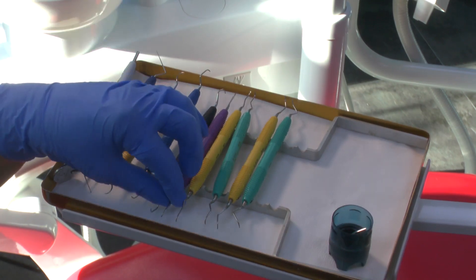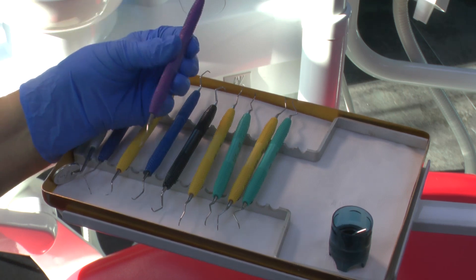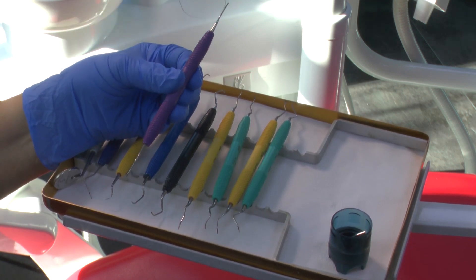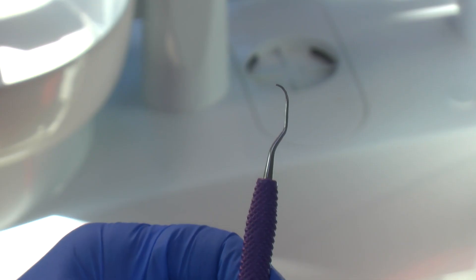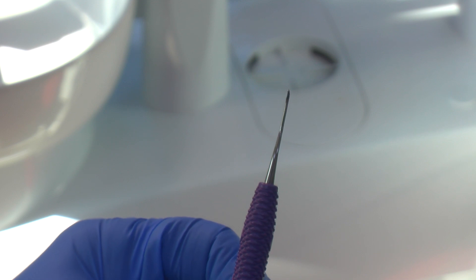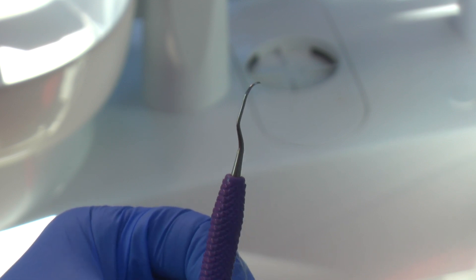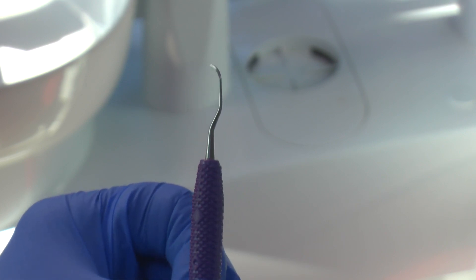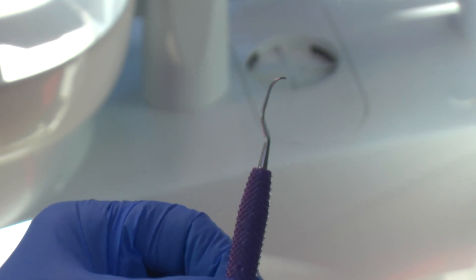The next instrument is a Gracey. This is the instrument I would use if I was needing to go further subgingivally because of the depth of the pocket, or I would maybe select one that had an even shorter toe. But this is the Gracey 1-2, which is for the anterior regions of the mouth because of the straight terminal shank on the instrument.